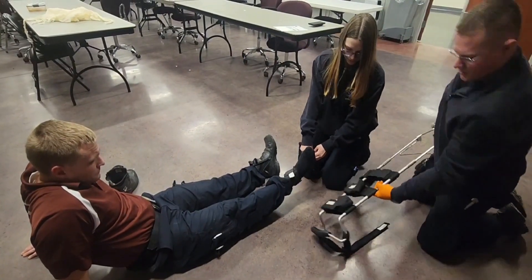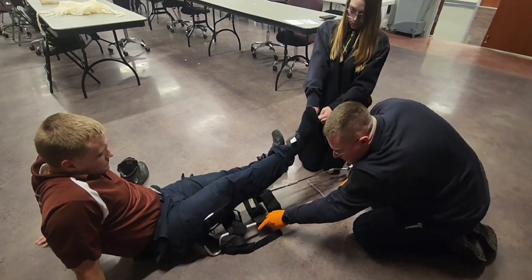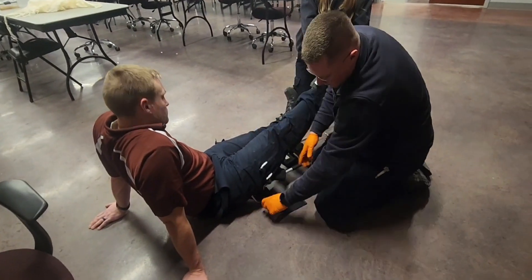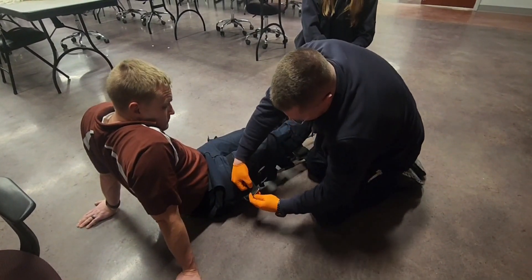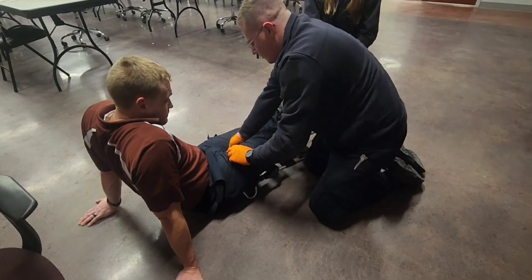I'm going to take the splint. I'm going to have my assistant lift the leg up while I slide this under. Make sure this is all the way in. I'm going to take the ischial strap, feed it through to the other end, and we'll hold that.